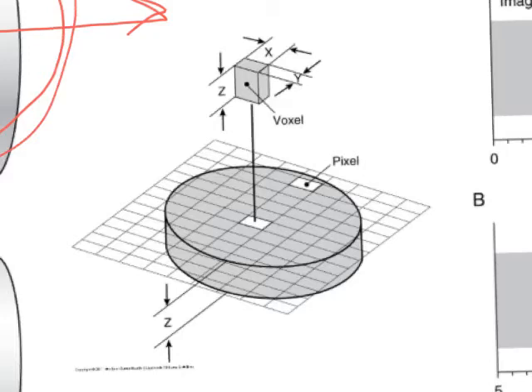Voxels are like the bigger, fatter pixel, right? It's a three-dimensional cube of data. So you can see here's my z-axis again, and this is why the z-axis will never change in CT, because it's tied to this stuff. So again, here's that imaginary line flying out of the screen and hitting you in the forehead, that z-axis, right? And so this voxel is volumetric because the data is being acquired over a distance along the z-axis.